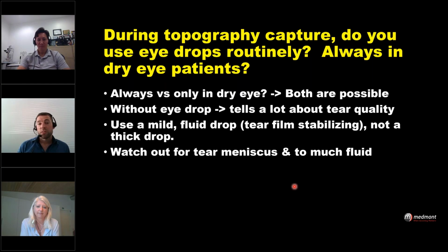Yes, thank you, Randy. It's a question we get a lot as a distributor and a trainer. What we hear in the market is some people always use eye drops. Sometimes people only use eye drops in dry eye. Personally, I'm in favor of only using drops in a dry eye, because it tells a lot about the eye itself and the tear quality.